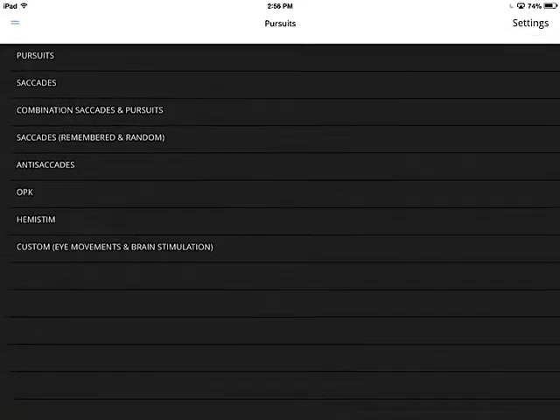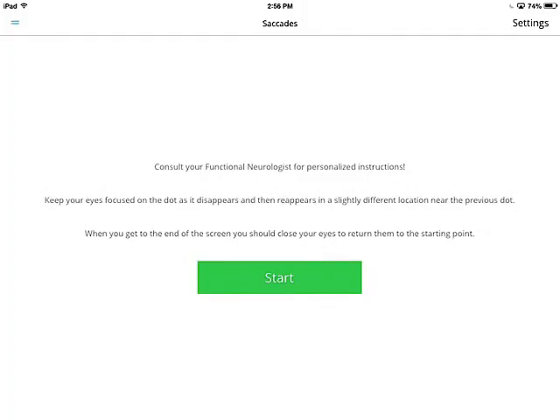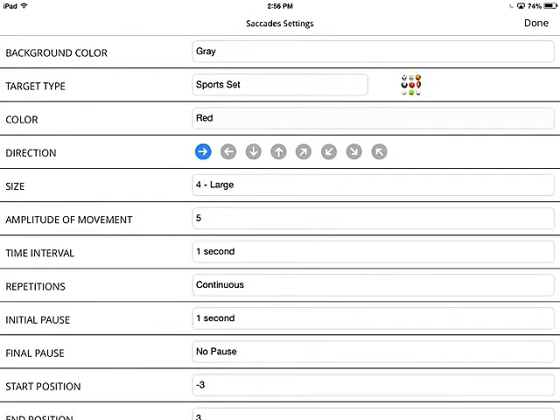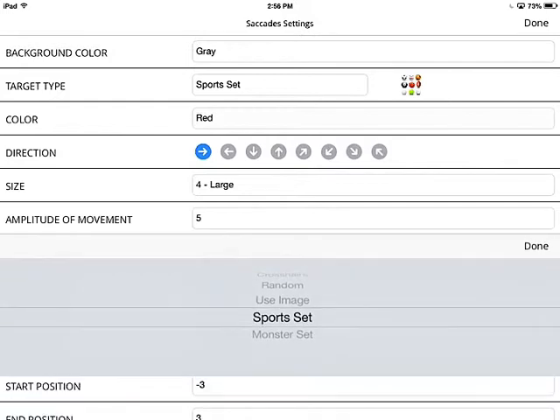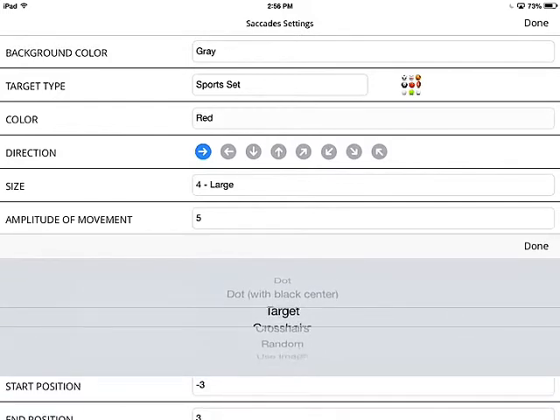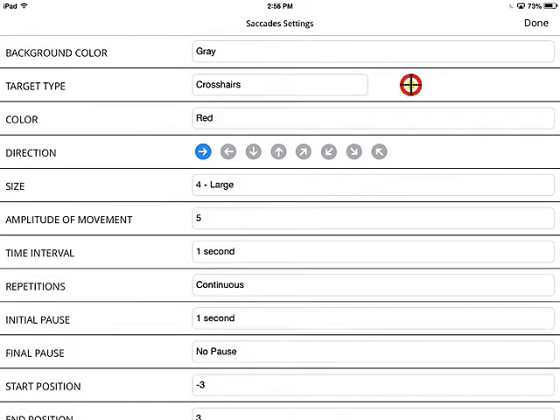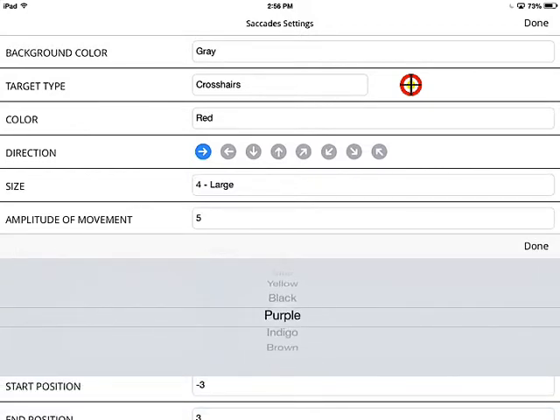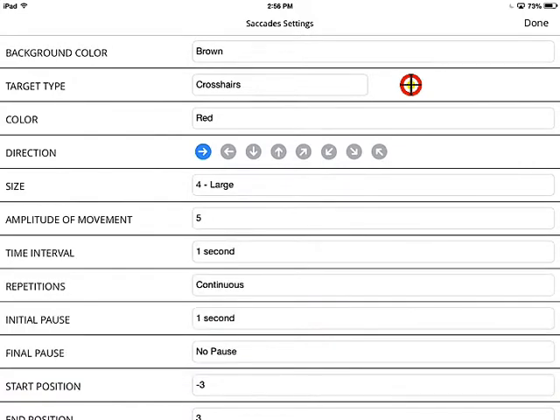Now let's go to saccades. Under saccades, it's really the same principle except that instead of a pursuit motion, you have a saccadic motion. Let's select the crosshairs target since that's the typical favorite. You can change the background color — let's make it brown, which is a little softer and not as bright as some other colors. The target color we'll keep red, and let's set the direction of movement to up and to the right. For size, let's make it medium.